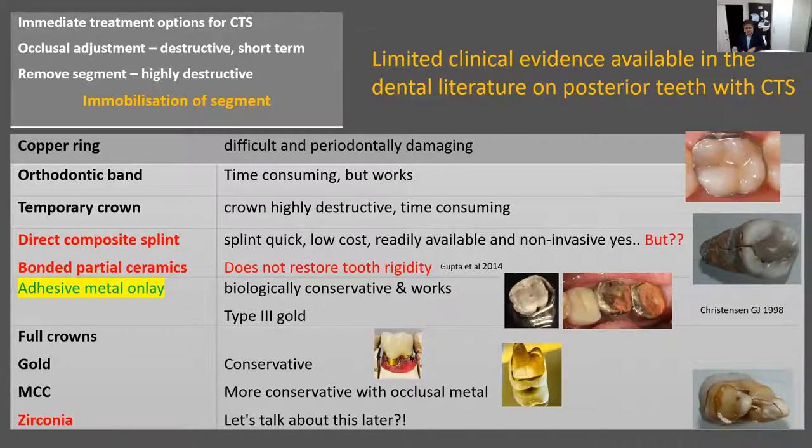And you've got full crowns, we'll come back to the full crown. And we'll talk about zirconia, I put it in red here, so that we'll talk about this later with time. And this on the right is a zirconia crown.